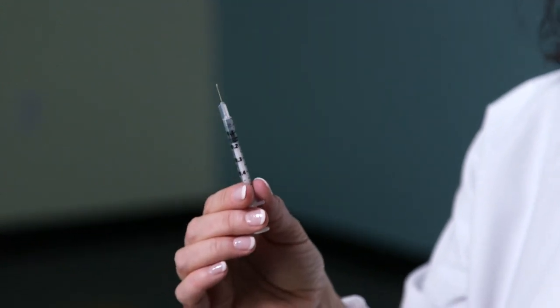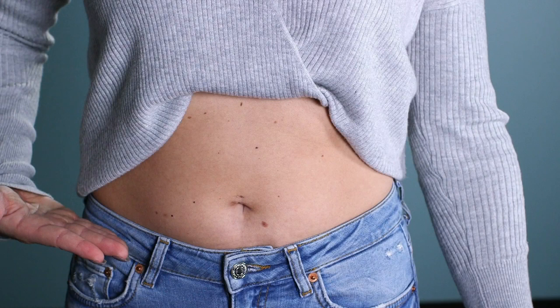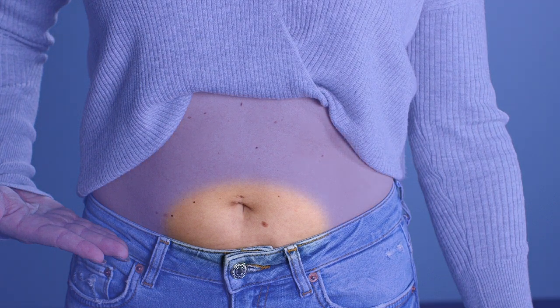You're now ready for your subcutaneous injection of Luprolide Acetate. For subcutaneous injections, make sure you wash your hands with soap and water. The most common site is the abdomen, using the left, right, or below the belly button, staying approximately one to two inches away from the belly button. You can also use the back part of the upper arm or the outer aspect of the upper thigh.